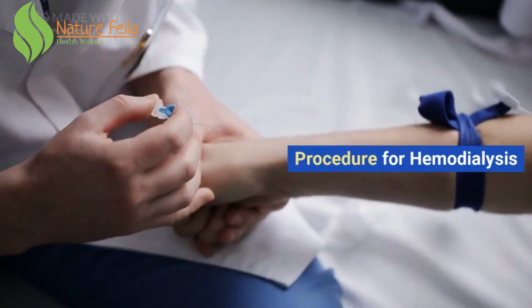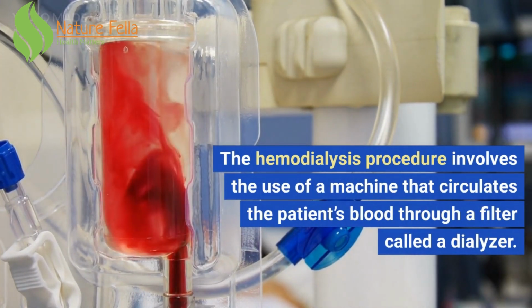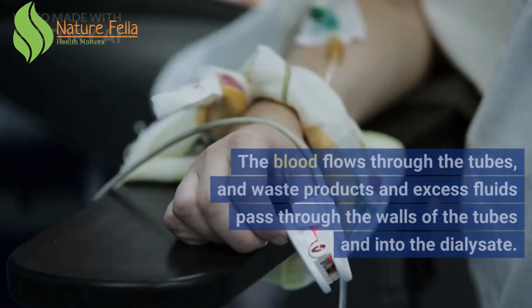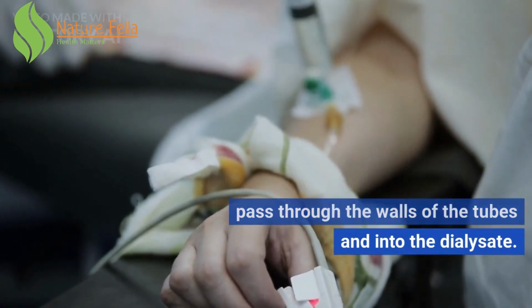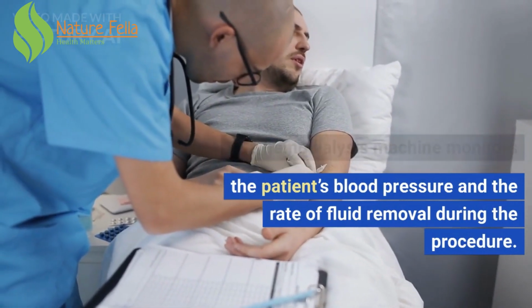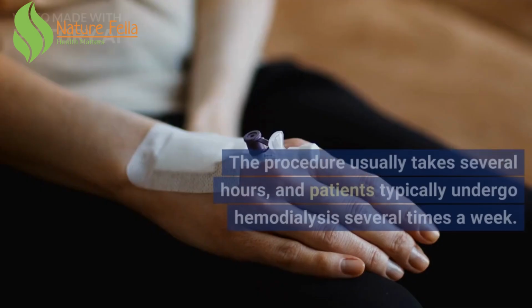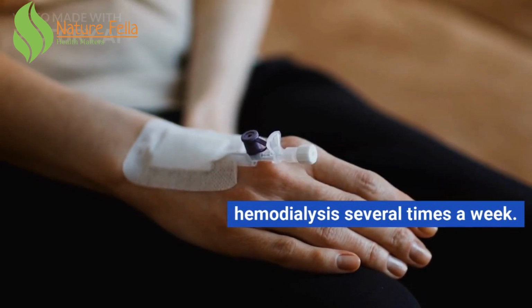Procedure for hemodialysis. The hemodialysis procedure involves the use of a machine that circulates the patient's blood through a filter called a dialyzer. The dialyzer is made up of tiny tubes that are surrounded by a fluid called dialysate. The blood flows through the tubes, and waste products and excess fluids pass through the walls of the tubes and into the dialysate. The hemodialysis machine monitors the patient's blood pressure and the rate of fluid removal during the procedure. The patient's blood is pumped out of the body, passed through the dialyzer, and then returned to the body. The procedure usually takes several hours, and patients typically undergo hemodialysis several times a week.